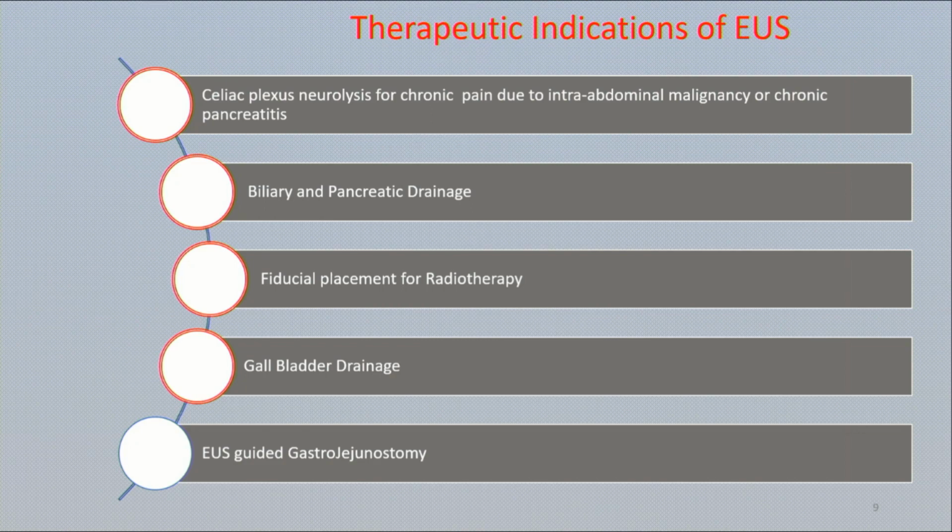And nowadays you can join, like a surgeon, the stomach and intestine in patients who are sick, who are not fit for surgery, and it can be used in the palliative setting in patients with advanced malignancy.